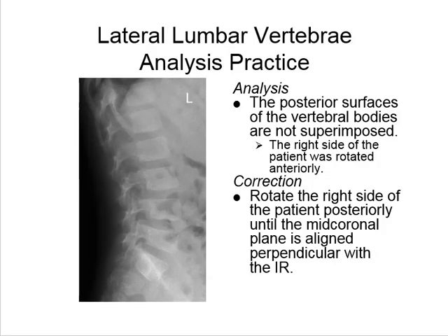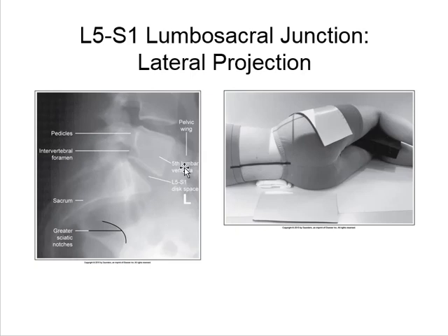So most of the time, in my experience, where I've had to shoot L5S1 spots the most are in patients who have a narrow waist and wider hips. So what our purpose for this one is just to see the L5 and S1 spot.